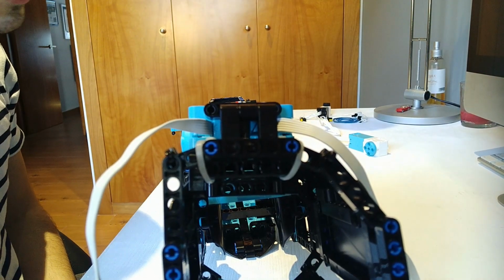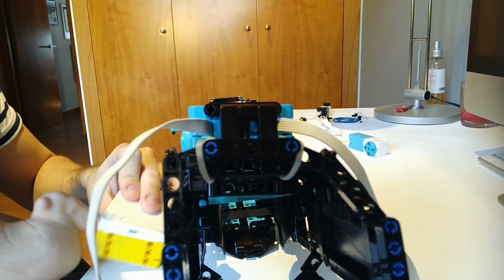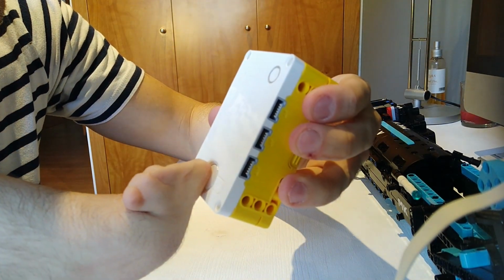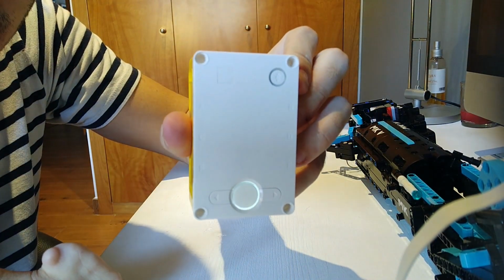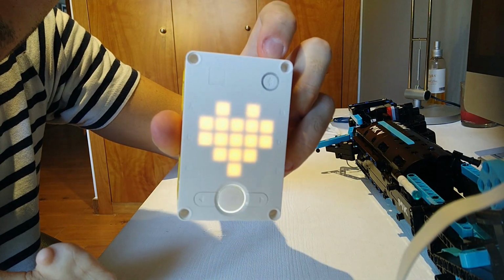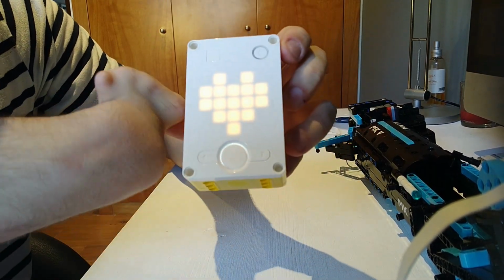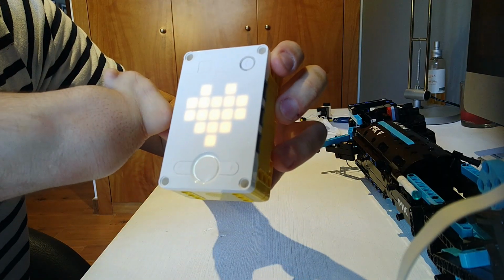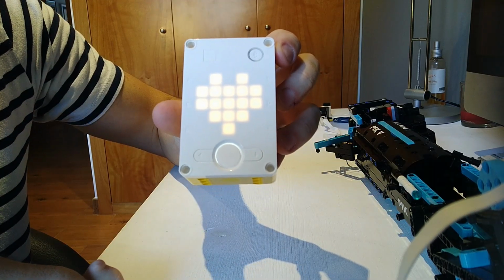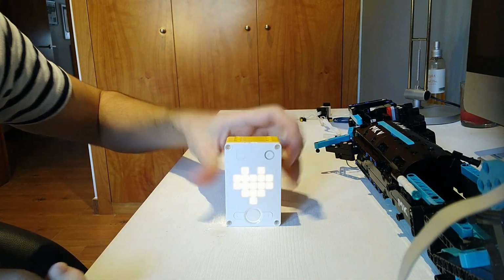And now we're going to the next step, which is connecting the motors to the hub. This is the Lego Spike Prime hub. You can turn it up. It can connect to your phone by Bluetooth, which is right here. And yeah, once we have this built, we are actually going to use 2 ports right here. You are going to get the C port and the E port, and you're going to connect the motors that we connected to the prosthetic. And it should look like this.